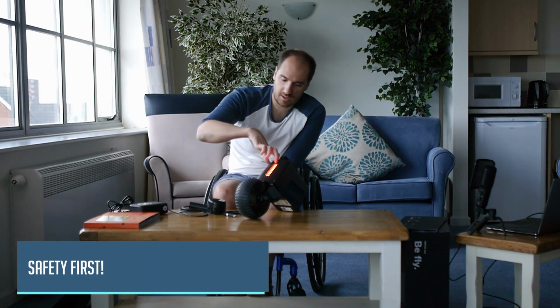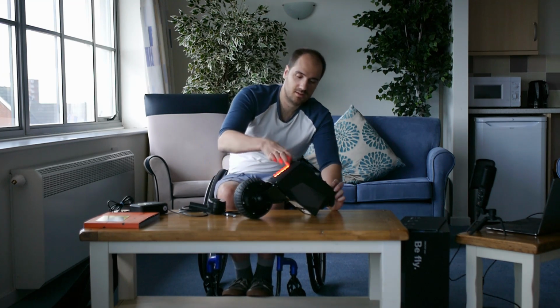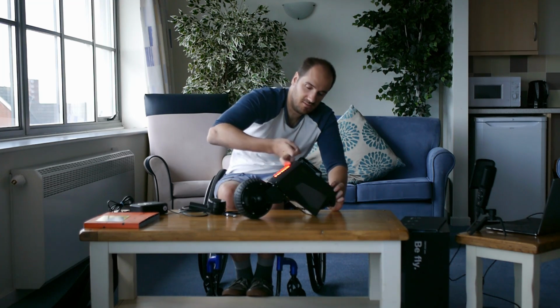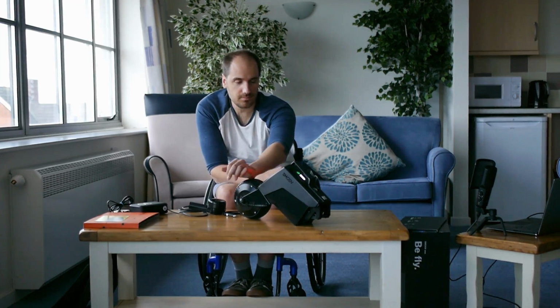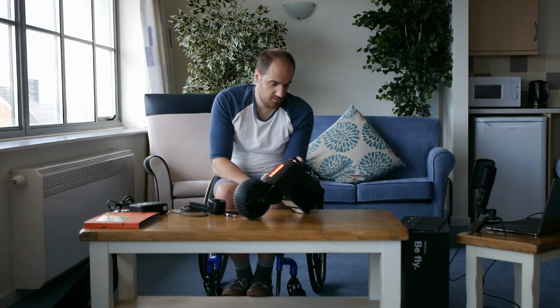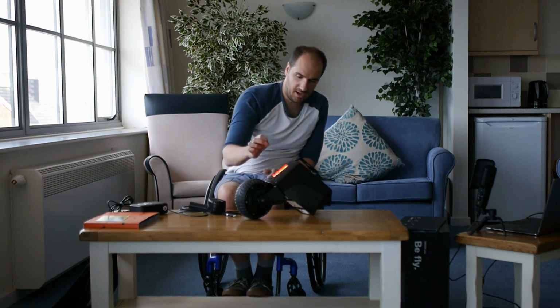Then moving on up, here we've got a little thing here, if I could flap that up. I haven't got the best hand function, so if I can flip that, no, well, we'll get back to that bit. Okay, so we move around and we've got the power on button, as you can see on green. We've got a battery level, which just shows you how much you've got. You've got some more bits and pieces, and then the handle itself, and then that clips on. But we'll get to that bit in a minute, how it all attaches.